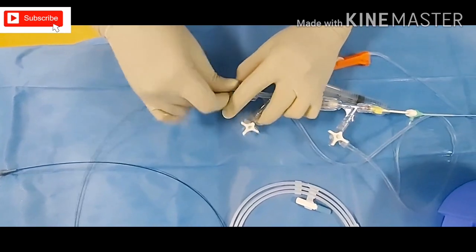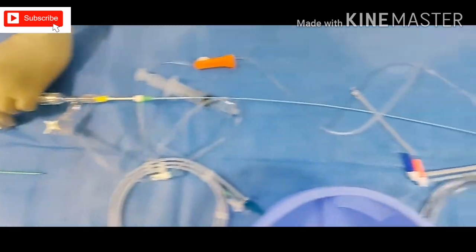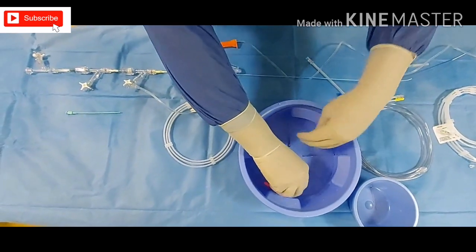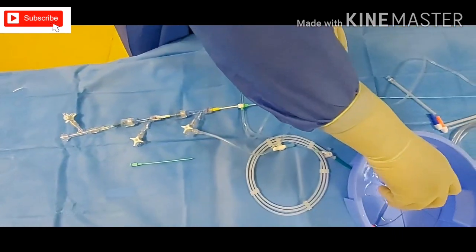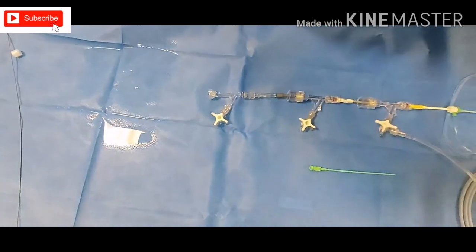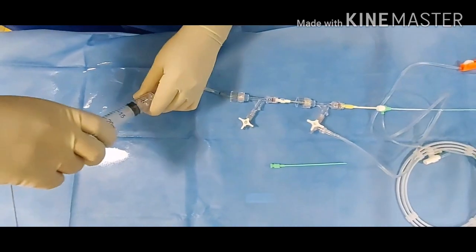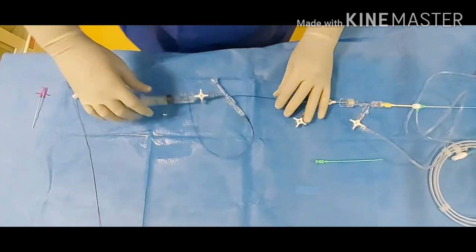It is a pressing-type Y-connector. Once your doctor reaches the targeted place, he will remove the wire. Then we will use the thrombectomy device. Once it is in position it is already deployed, so we will keep the revascularization device there for two to three minutes. After that, your doctor will ask you to aspirate — so from here he will say aspirate, aspirate, aspirate. You will just pull the plunger and aspirate continuously until it locks. Don't release your plunger — keep aspirating. He will give you the sofia catheter, and you will flush everything out and be ready for another attempt.